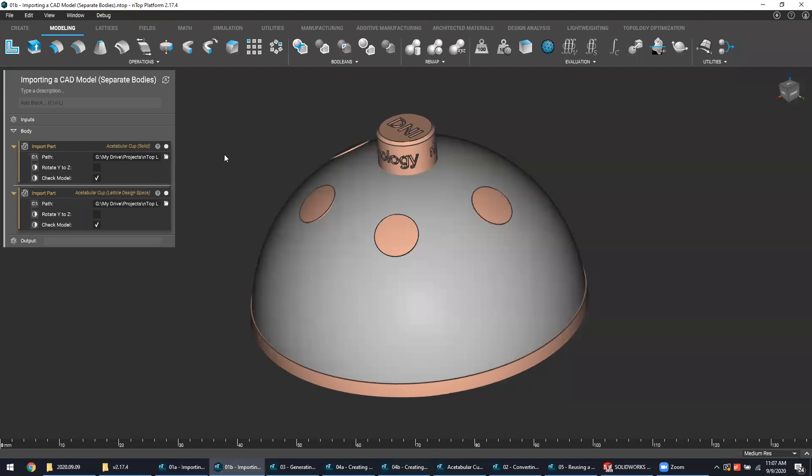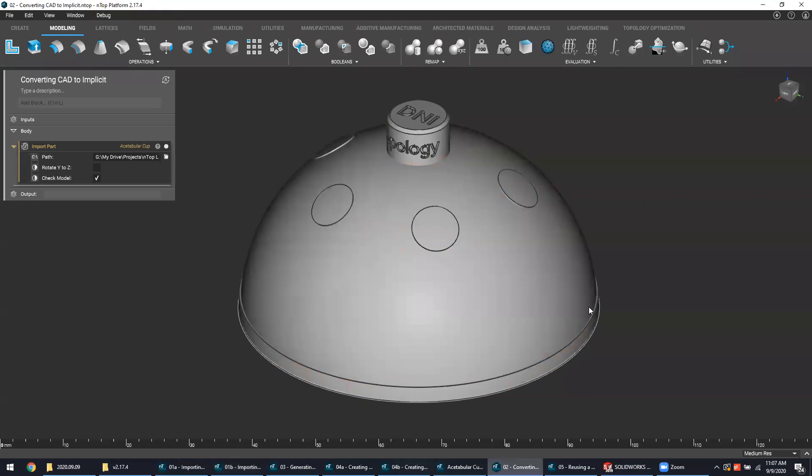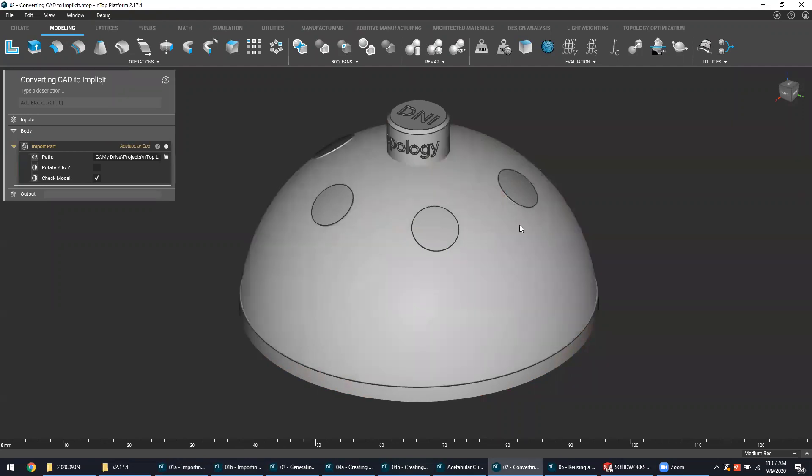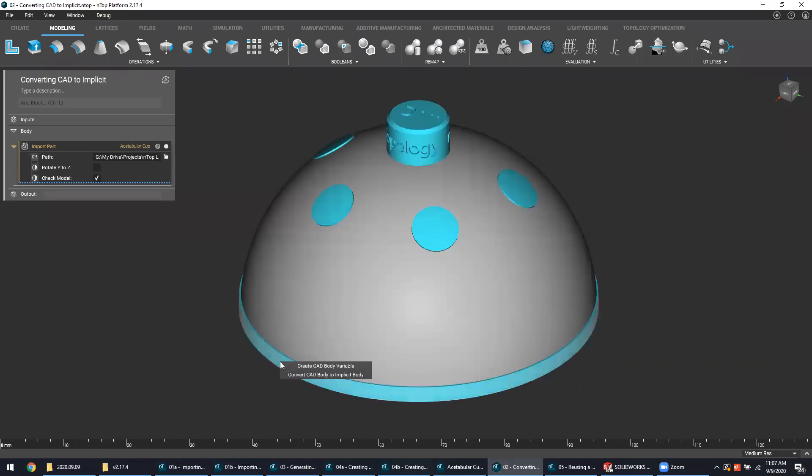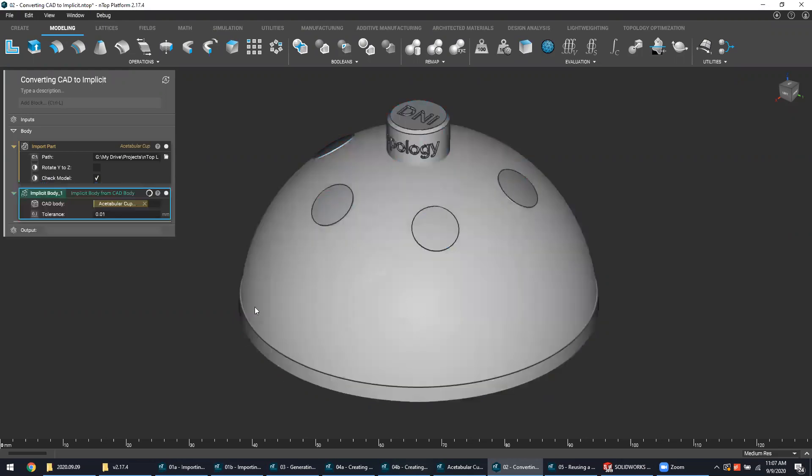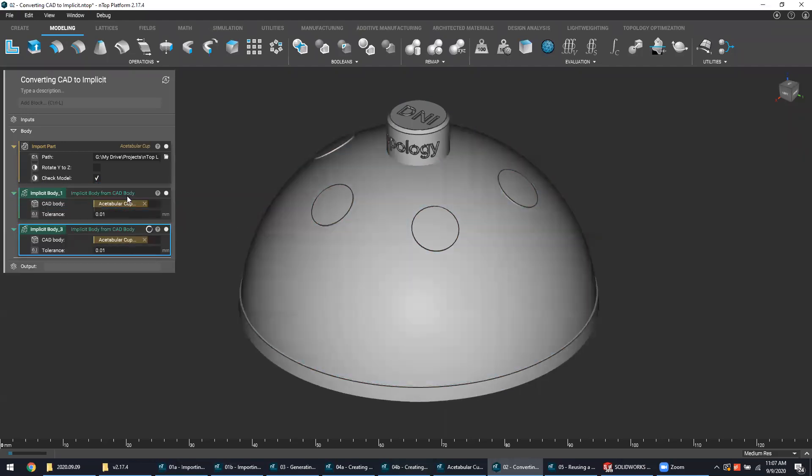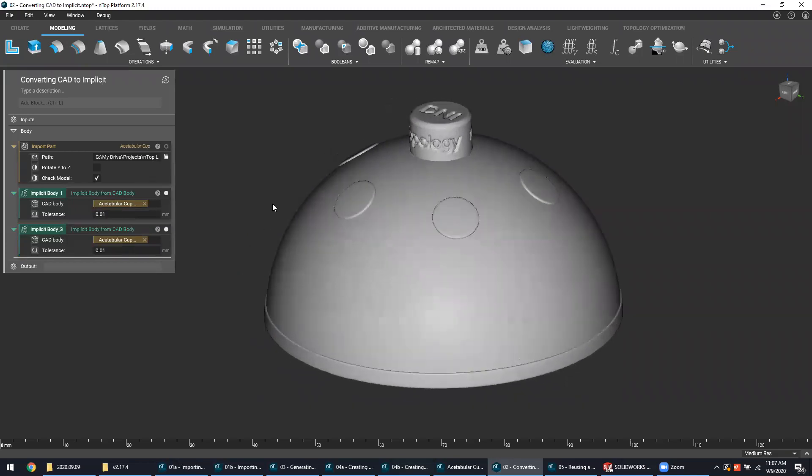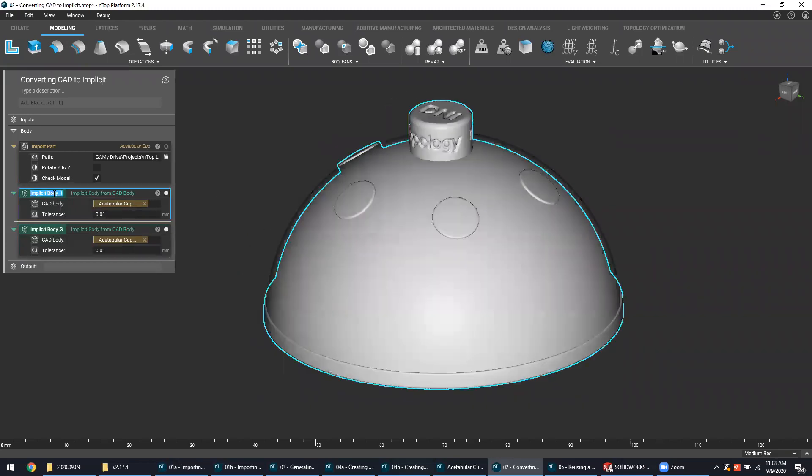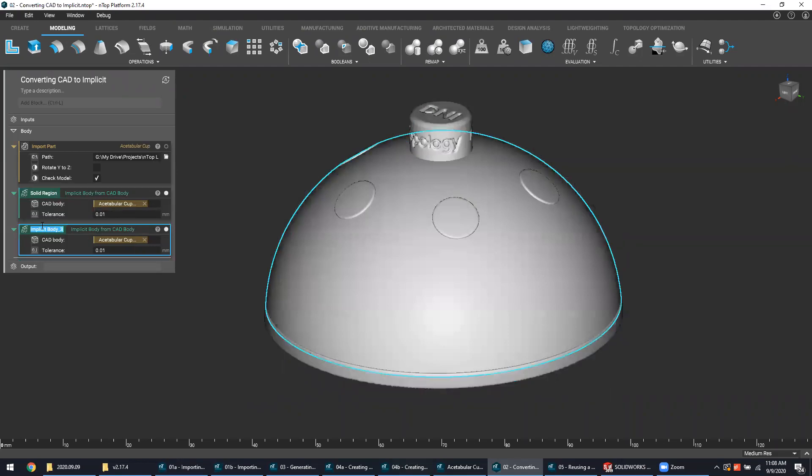As you may have heard, NTOP platform is a fast and powerful design solution because it leverages implicit design technology, and thus represents the geometry as an implicit body. Because there are two imported CAD bodies here, the next step would be to convert those to implicit, and that can be easily done by double clicking on each body, right clicking them, and then choosing the convert CAD body to implicit body option in this menu. With each selection and conversion, you can see that the new green blocks appear, each representing their respective converted implicit bodies. For good housekeeping, we're going to rename them as such: we'll call this our solid region and this our lattice design region.